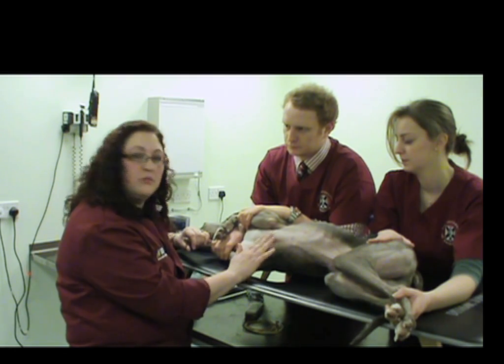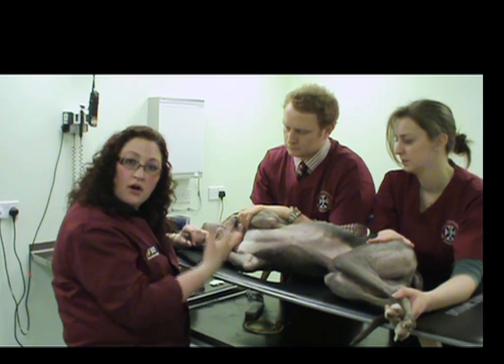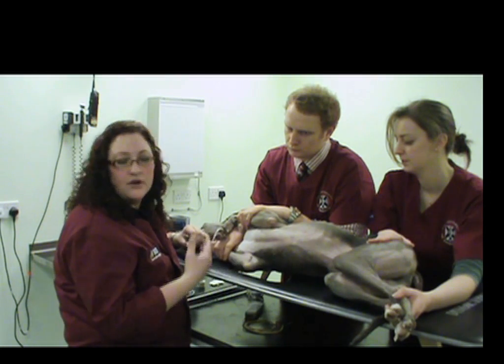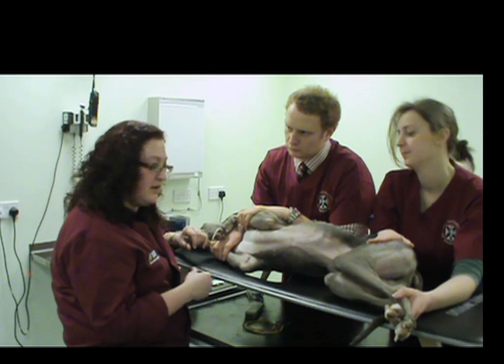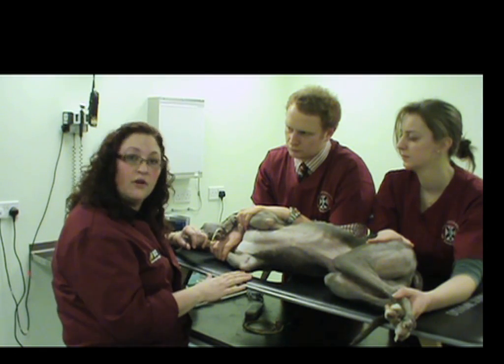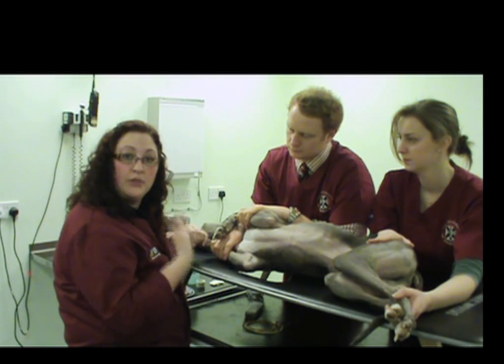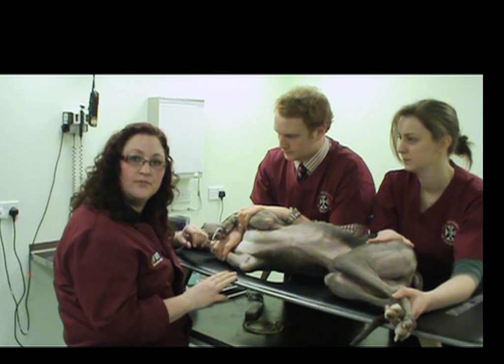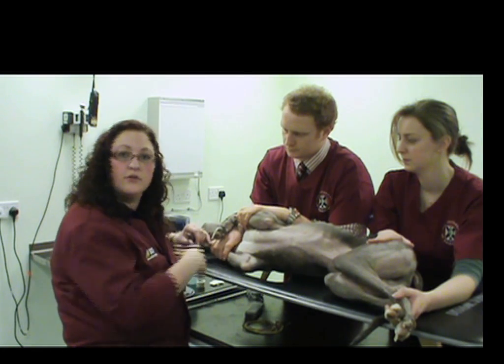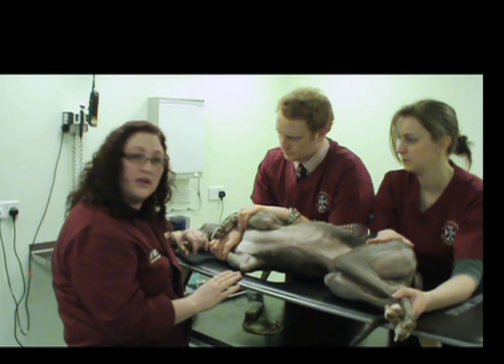Today we'll be focusing on black and white B-mode images, but color Doppler and other forms of Doppler are very useful for evaluating the integrity of valves and other structures within the heart. However, there's a large amount of information you can glean from performing a black and white echo study, and most practices that have ultrasound will have a machine capable of these functions.